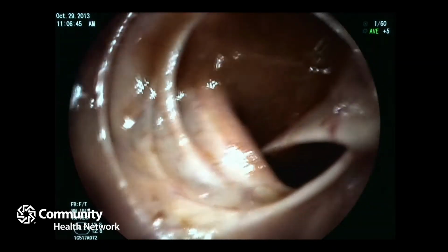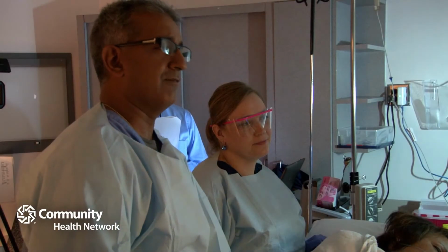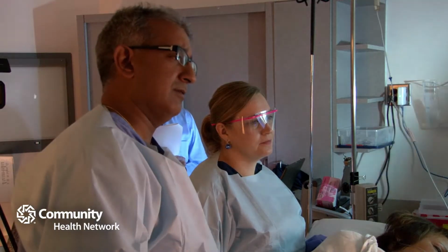You can see I'm working my way through, and there are some turns, and here we run into stool again. So it's just kind of deliberate. Colonoscopy is meant to be a benefit, and so people should get it done. And again, it isn't what it was before in terms of sedation and recovery and the preps.